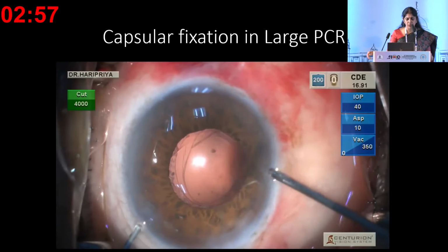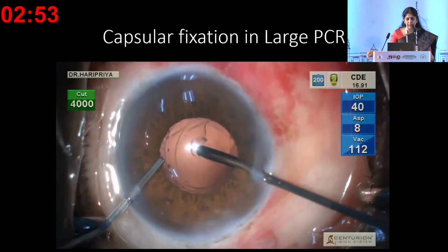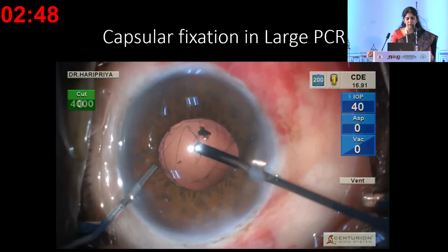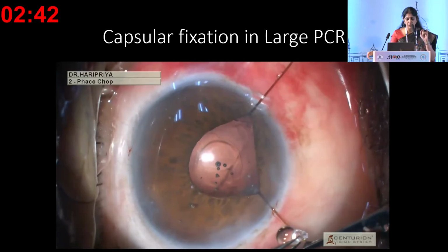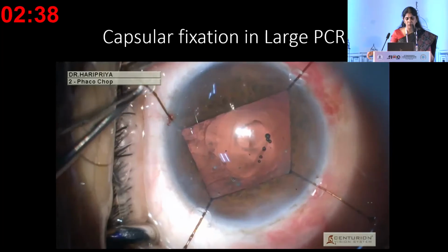This is another case where I chose to do a capsular bag fixation, but this is a large rent. Again, before placing it, a vitrectomy is important. Here there is a large rent in the center, so you can have the cutter facing down, and you can see the capsule rim of the rent is straightened, which means the vitreous is pushed back.